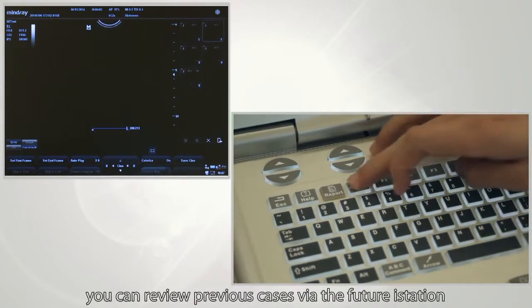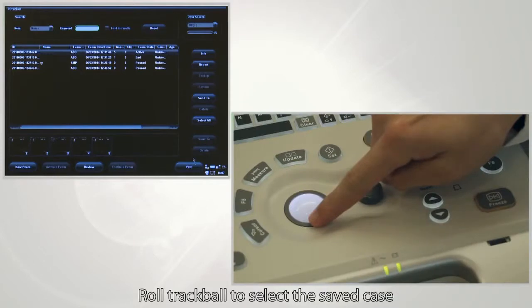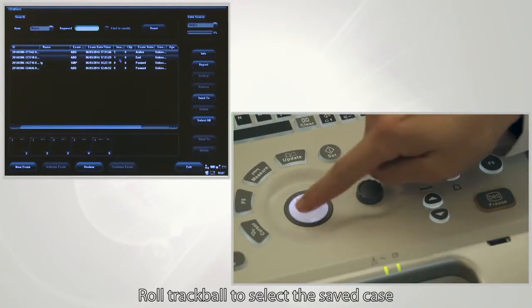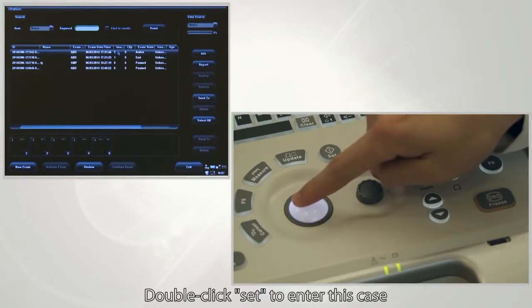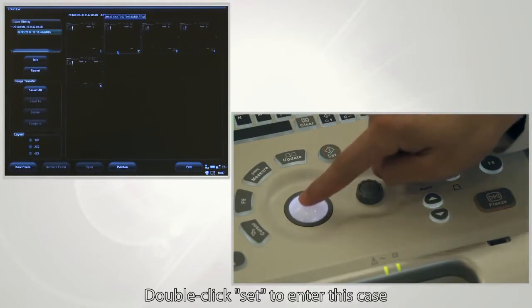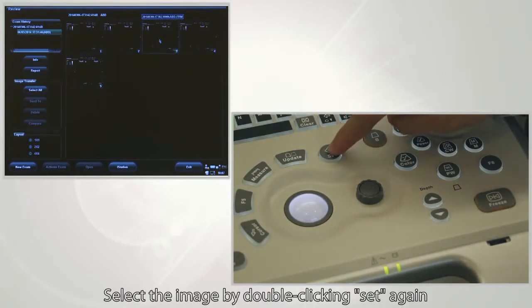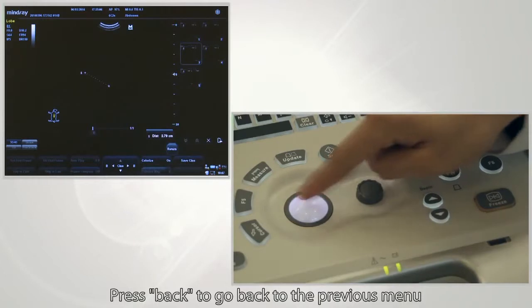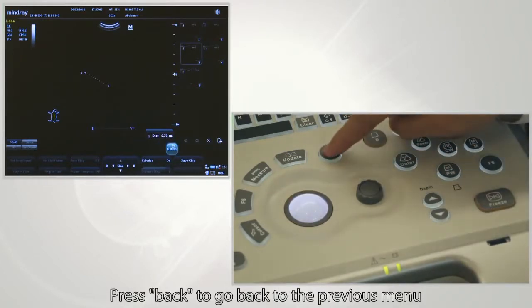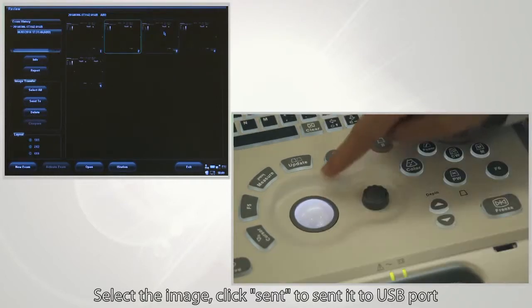You can review previous cases via the iStation feature. Roll the trackball to select the saved case — blue highlight means it is selected. Double-click Set to enter the case, then select the image by double-clicking Set again. Press Back to go back to the previous menu. Select the image and click Send to send it to the USB port.